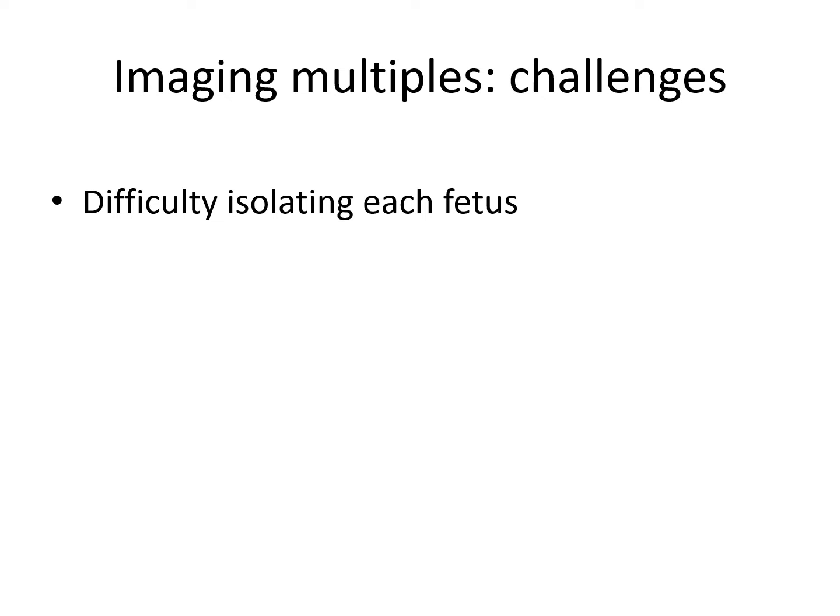Scanning multiples can be very intimidating, and so there are many different challenges that we face while scanning multiples, the first of which is difficulty isolating each of the fetuses.